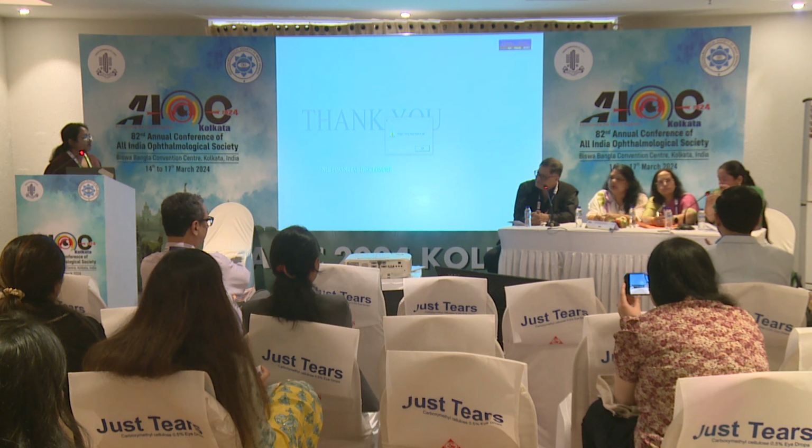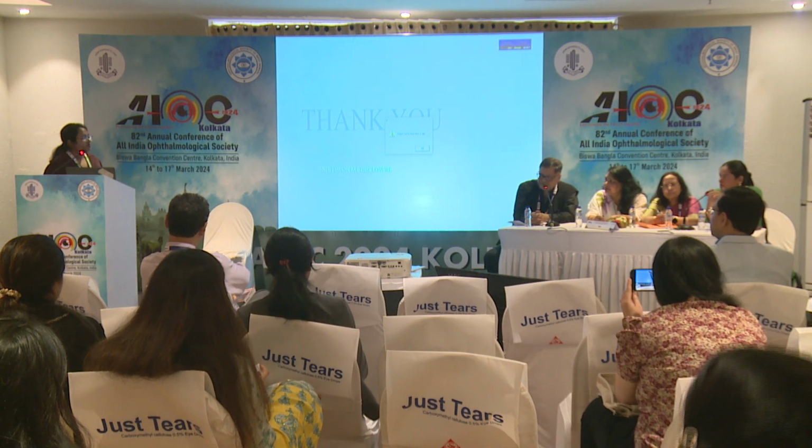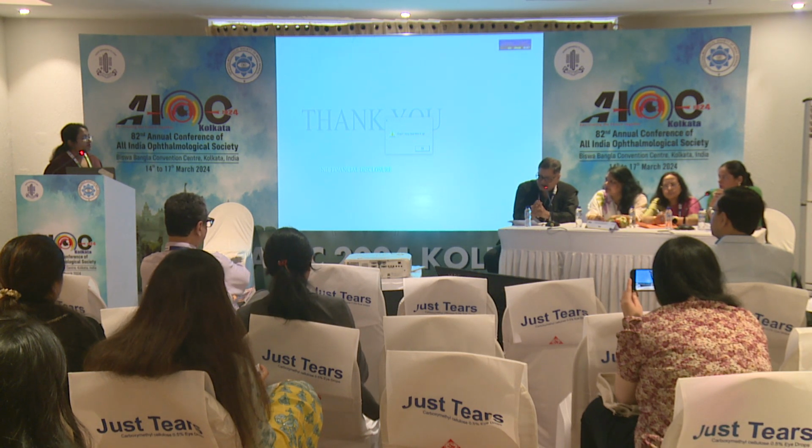The video which you showed, that it fractured with the 2-dialer, but when it's a very early soft cataract in NS1, it's not easy to fracture it. The only one video have. Please collect all your cataract cases, and so if it comes out so nicely, it doesn't happen actually. This was not a soft cataract. This video was not the one shown, 2+.